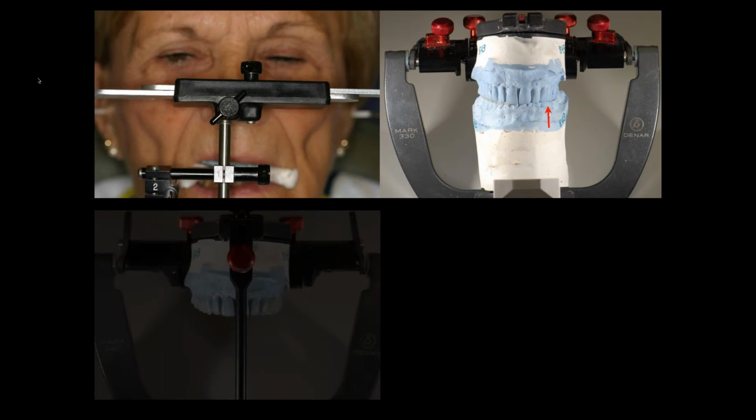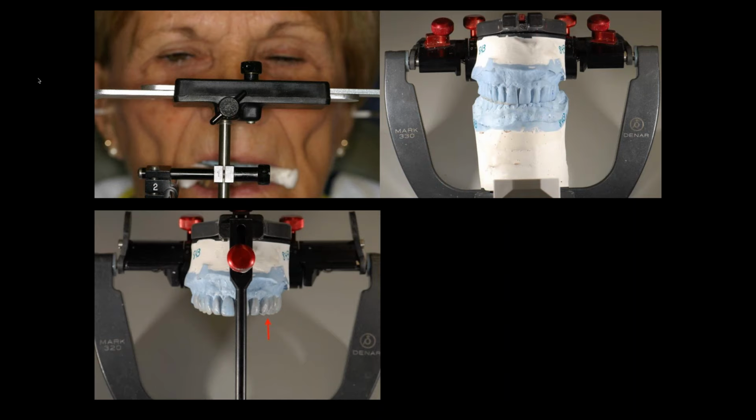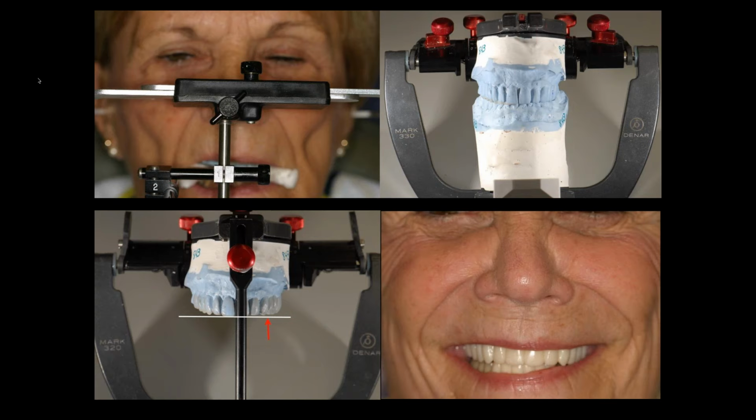Okay. We did our wax up, we lengthened that side. We got the incisal plane horizontal to the tabletop. We got our midline vertical. We got everything perfect, and it goes for delivery, full arch case, and oh my God, look what we got. Shoot, we look at this line. Here's a picture you sent me, it's the best I can get. And we're off a little bit on that cuspid, but it's not as much as it seems from her smile. So I went back and started looking back at the stuff.